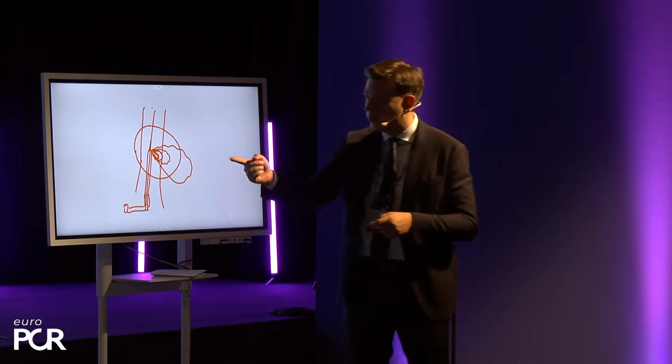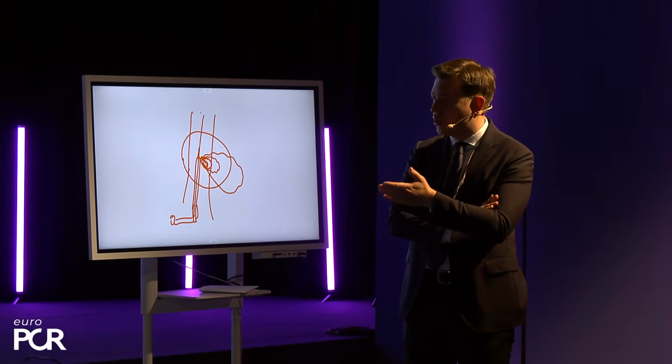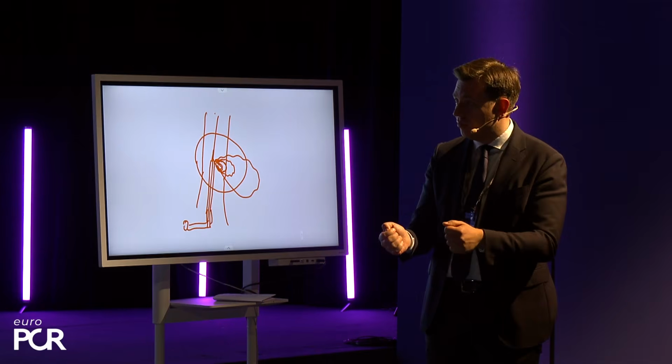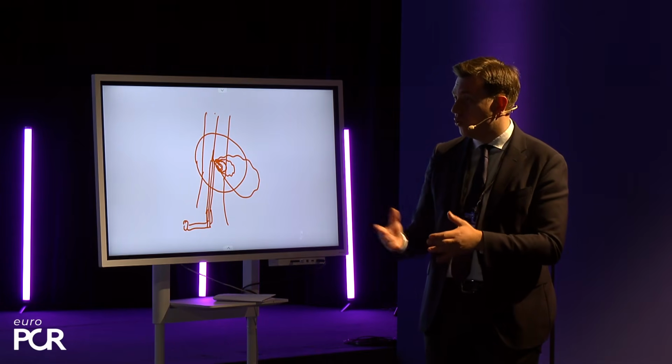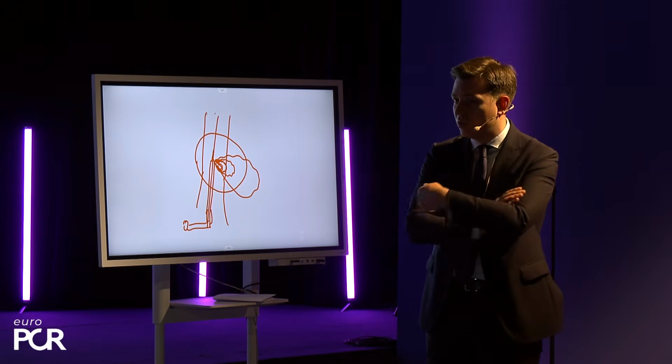But I would like to hear from Wolfram and Maurizio, what are your strategies for contrast? Do you inject contrast at the end before you lock in to have a control? Do you do it from the same side? Do you do it from the other femoral? Do you do it from the radial? What is your strategy?